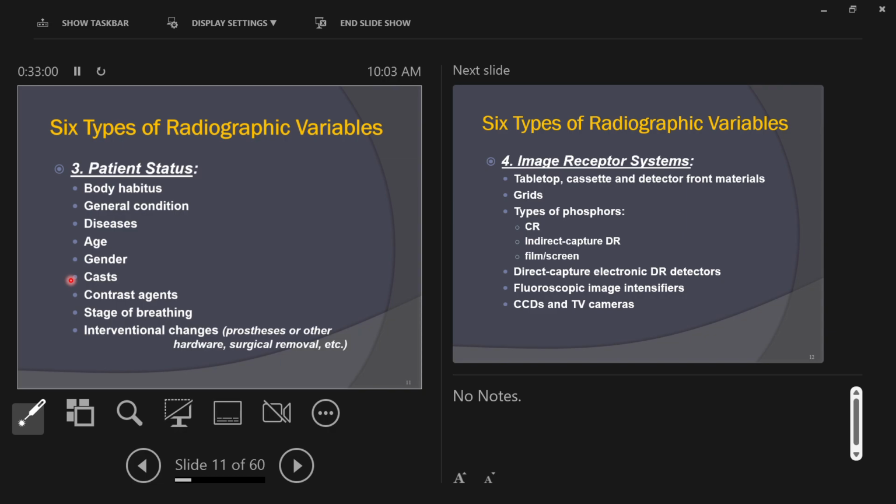A disease process example might be a pneumothorax, a collapsed lung, okay? Air in the chest, right? There was a lung here. It has now collapsed. There is less tissue now in the way of the X-ray beam. We would call that a subtractive condition, okay?